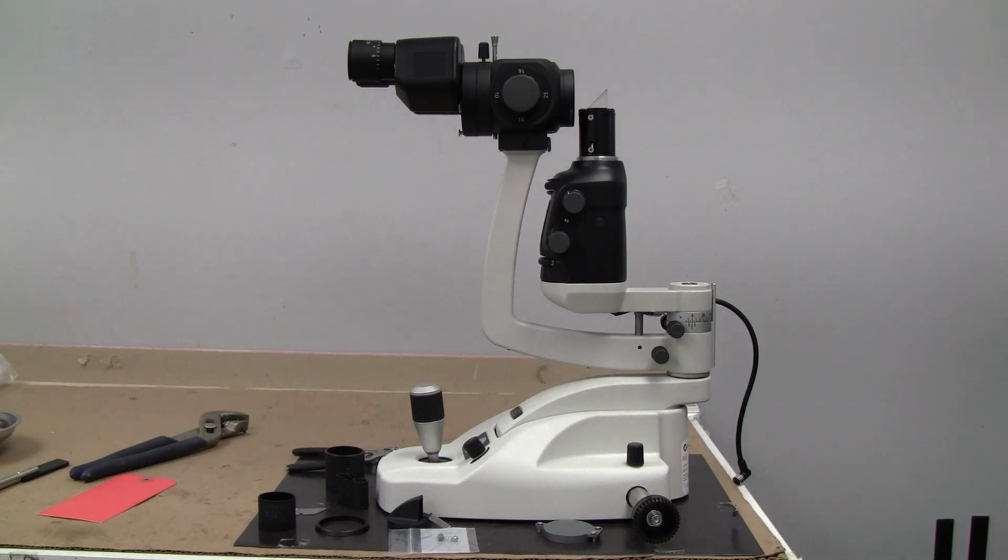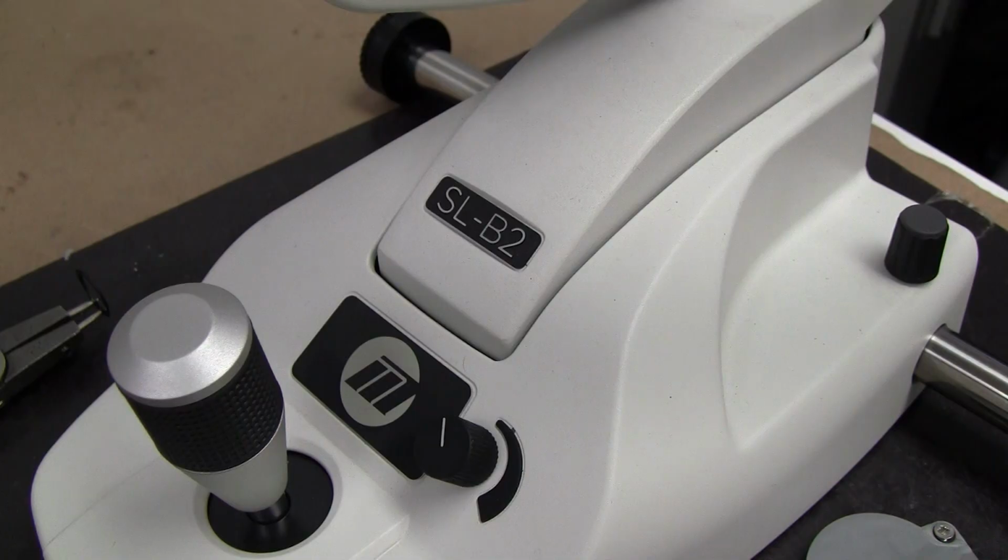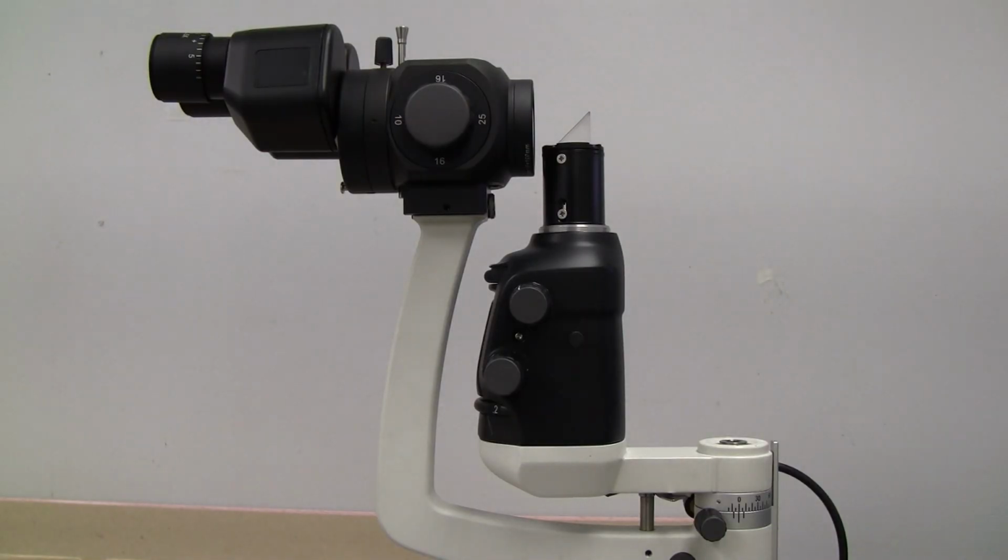This is a global slit lamp manufactured by Keeler, and this one has a Marco label on it. And I'm just going to give an overview of things that you might have to do to it.